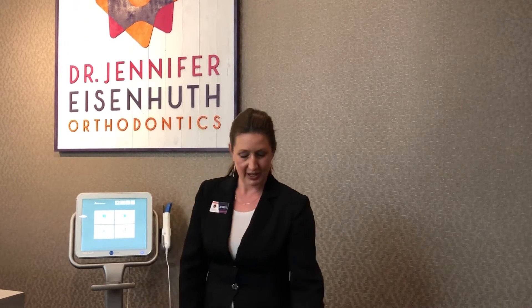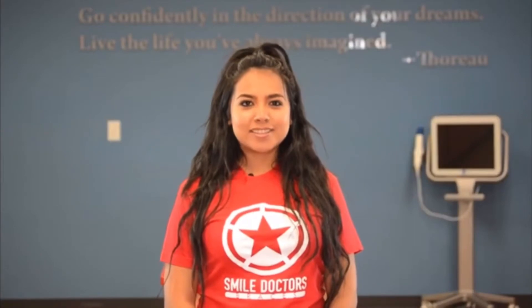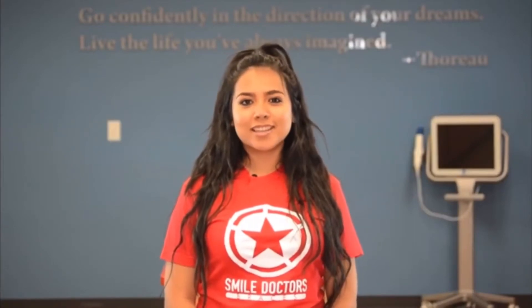Using your scan box and cheek retractor, one of our assistants is going to show you how to take a scan. Taking a scan is very simple and will only take you about one minute once you get the hang of it. Hey, it's Yasmin. Taking a scan is super easy and takes about one minute of your time once you get the hang of it.